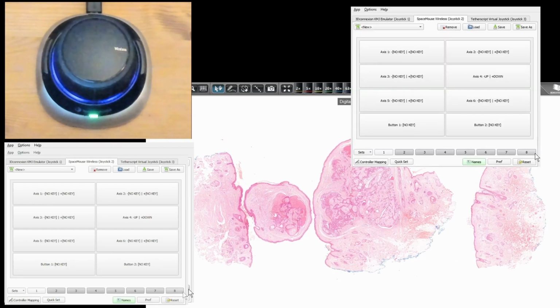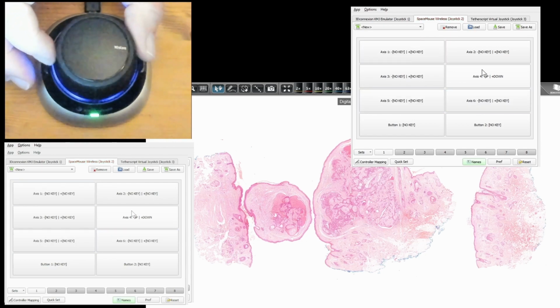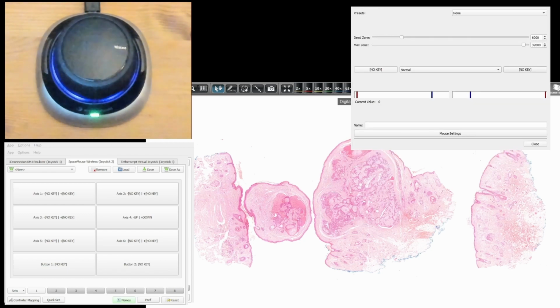This is one of them. Once we sort it out, we need to figure out the left and right. We see which axis is active, we double click on it, and once we get into the very same looking interface, we will be able to assign the left and right keys very similar to what we have done with the up and down keys.